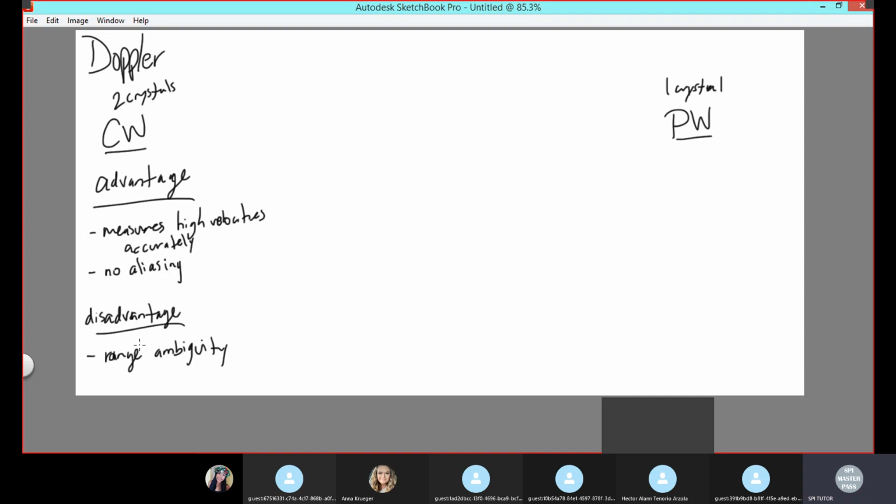Okay, so in this case, they're talking about the 13 microsecond rule, which is where things are, essentially the location of things, because that is what the range equation tells you. Every 13 microseconds, you're 1 centimeter away. That is your location. You're 1 centimeter away. So when you put these two things together, it just means that it is unsure of its location. Okay, that is range ambiguity.